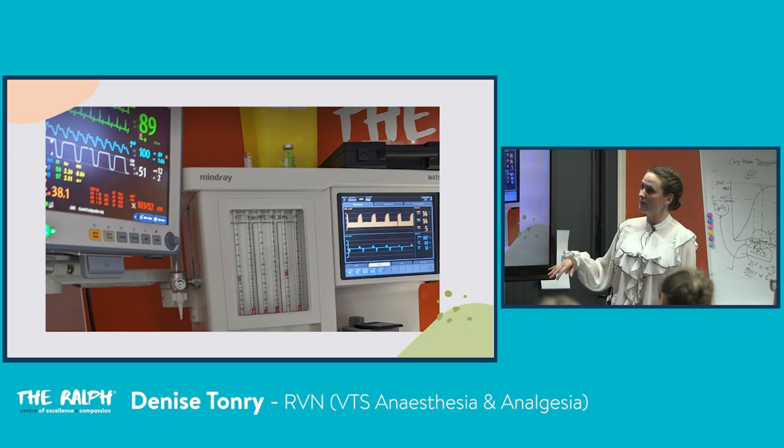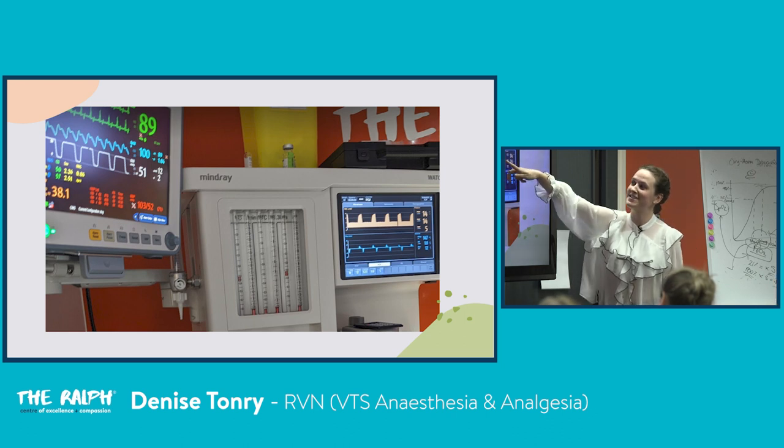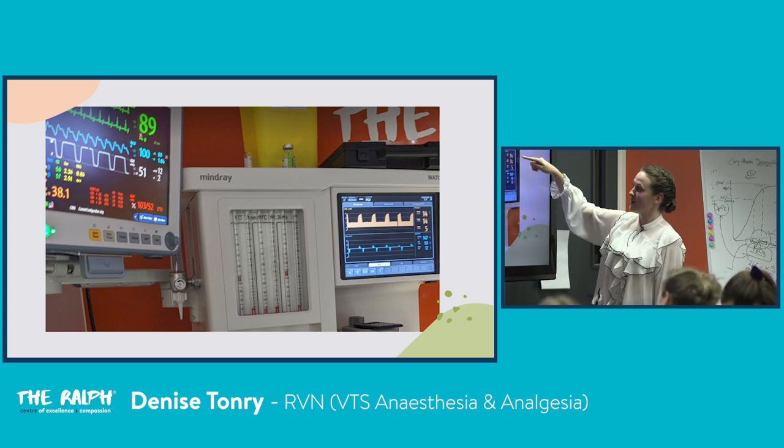This is just a very bad picture, but shows ventilation and an end tidal of 51. And you can see sometimes we ventilate them.